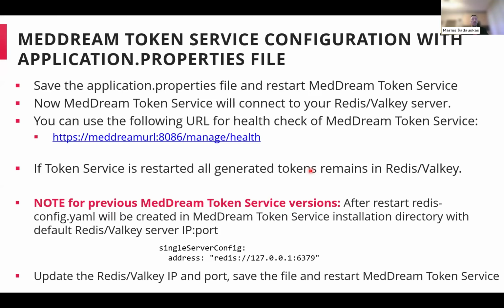In principle, if you restart the token service and some tokens were generated, after the token service comes back, it will work just fine, and you don't need to generate new tokens. While in the standard installation, if you restart the token service, all the tokens would be lost. So this is also one of the advantages of using the Redis or Valkey service. And for the older token service, it is also the same.